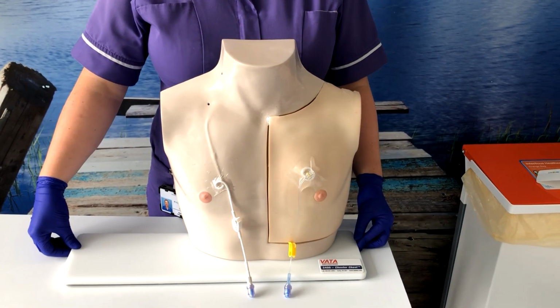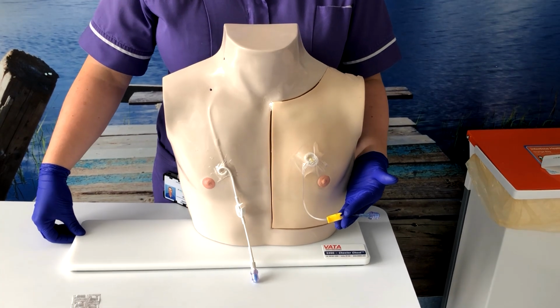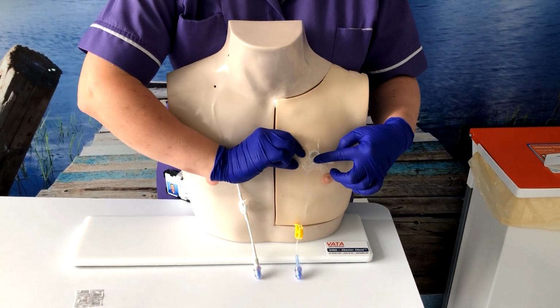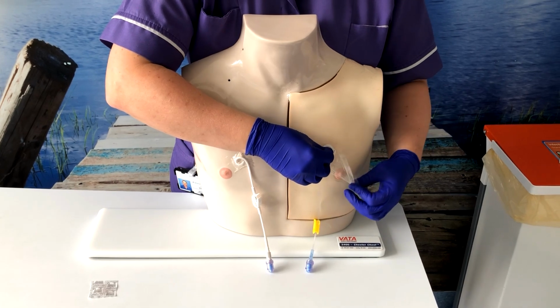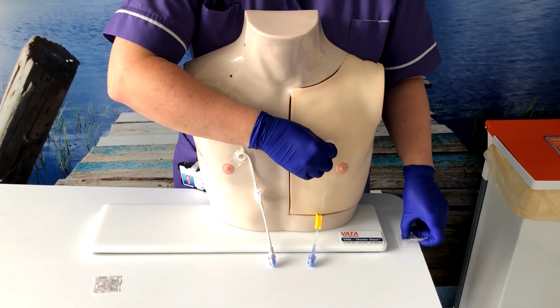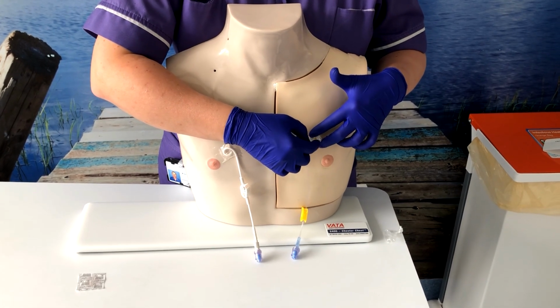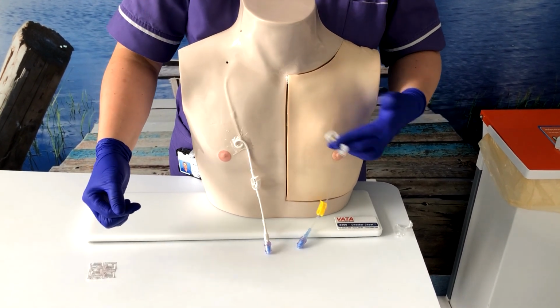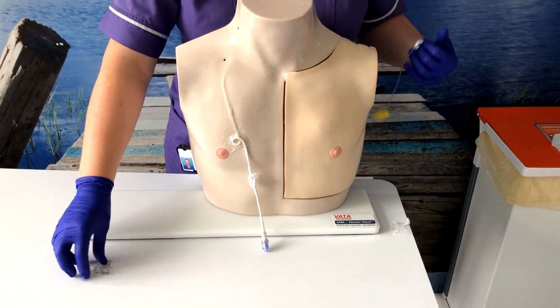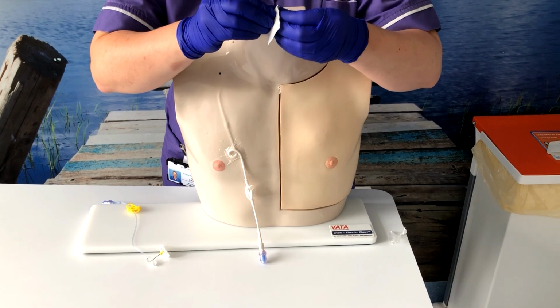So to de-access the port, you need to make sure that it has been flushed and locked with heparin before we take it out. Remove the dressing. Ensure that you support the port so that you're not pulling out on it, and pull the needle out. You may want to put a spot plaster on.